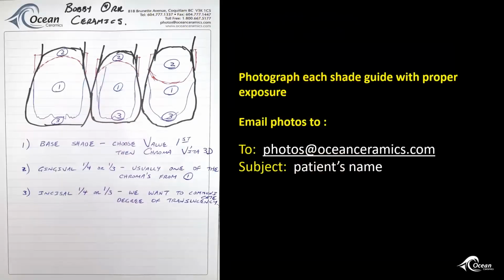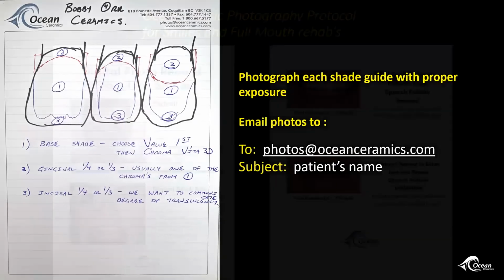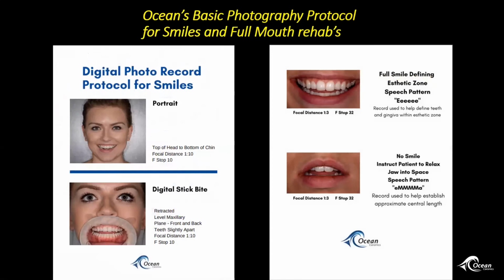So I've just checked with Mark Stevenson. You can take these kinds of photos with the iTero Element system. So sorry, you can take the scan and marry it to these photos. Oh, I see. Yes. Okay, all right.